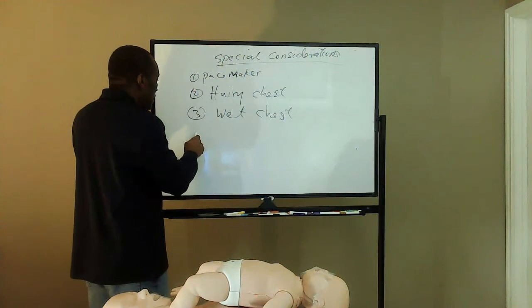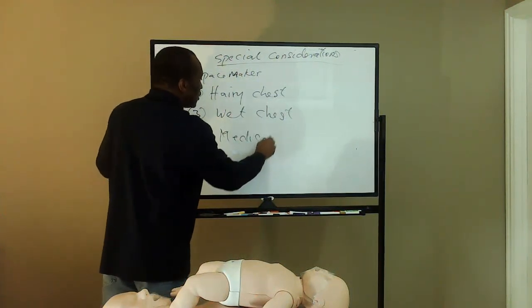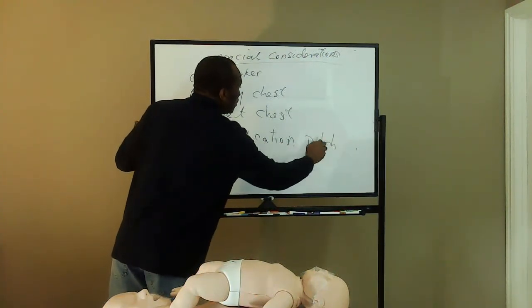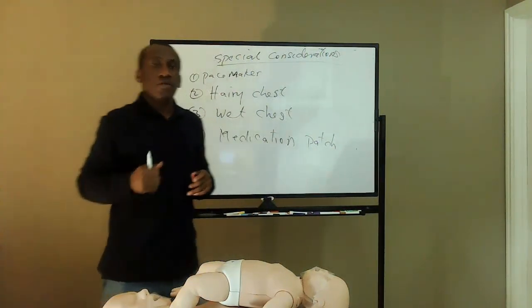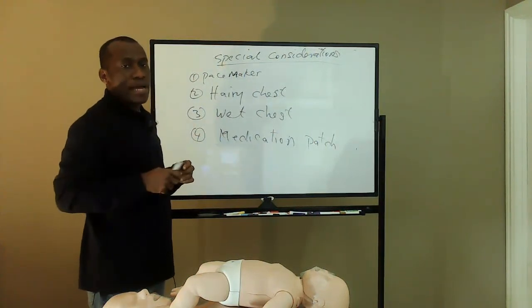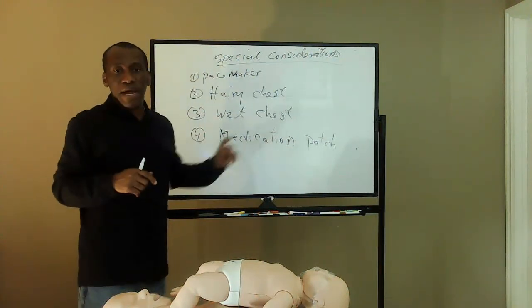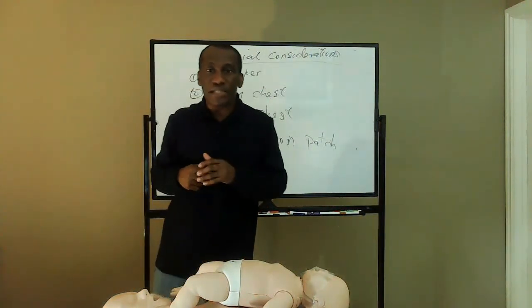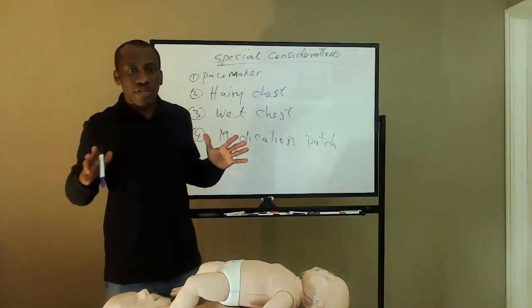Another one is a medication patch. If you have a medication patch or patches at the spot where you need to stick the pad, you need to remove the medication patch, wipe the area, and then put the pad. Don't put the pad over a medication patch like a nicotine patch or nitroglycerin. You can also use it on a pregnant woman. That's okay, it doesn't harm the baby.